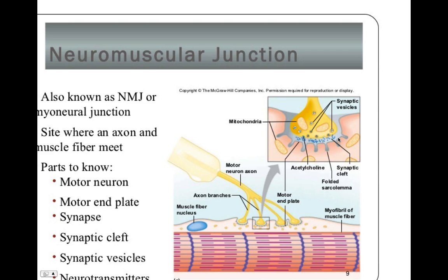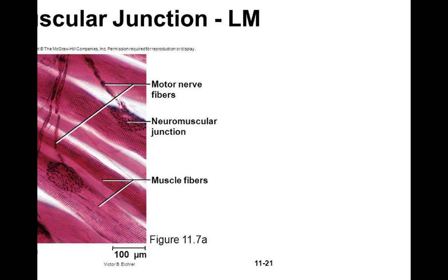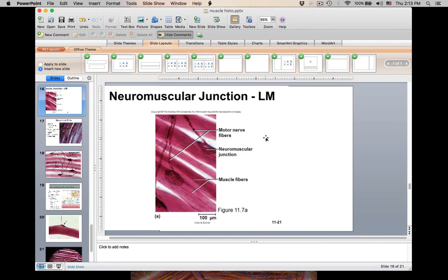And then let's look at, I am going to skip that one. Oh my goodness, I'm not sure why it's not showing the whole slide. Let me move this over here.